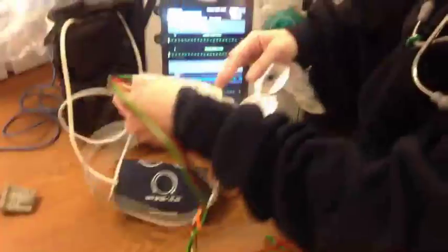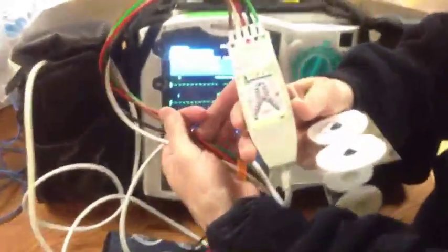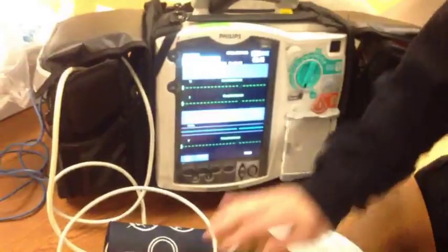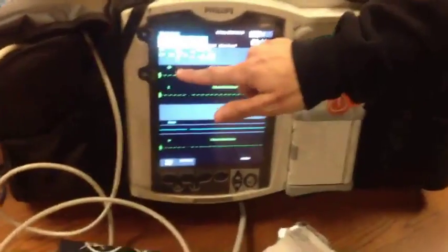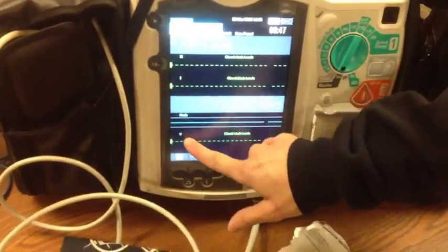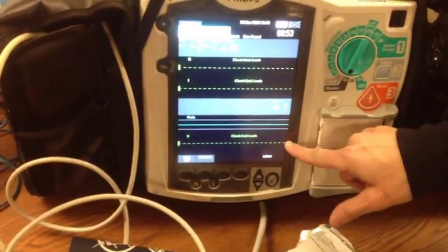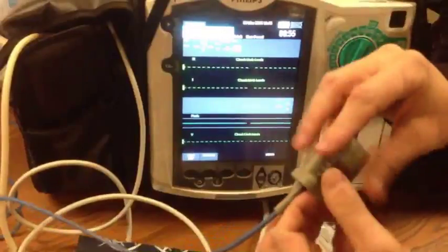This monitor does have a lead placement reference in case you need to refer to your placement of leads — it is there for you. The monitor automatically defaults to Lead 2, Lead 1, and a V-lead, V1. The actual tracing will come up in green, and when you take the pulse oximeter and put that on the patient's finger, you'll come up with the SpO2 reading. When you have a screen that you want to capture, you go over to the right-hand side and push the button underneath the monitor to print your EKG strip.